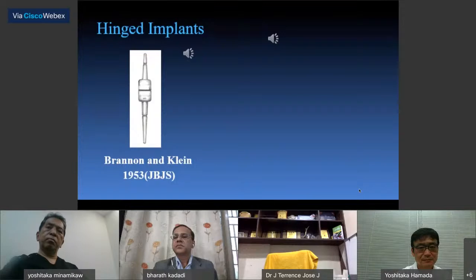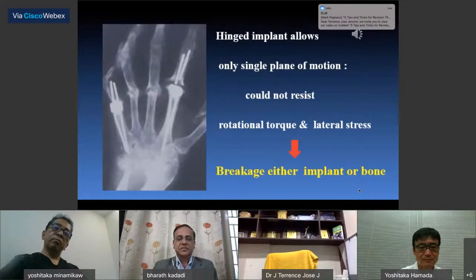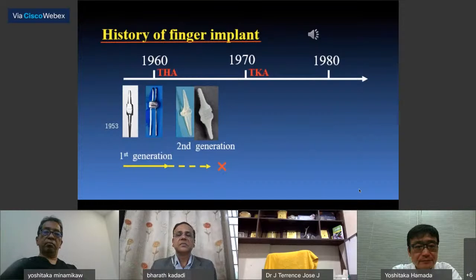Platt modified the single stem with more flexible and longer twin stems for better fixation, and it was extensively used for rheumatoid cases. The hinge implant allows only single plane motion, not rotational torque and lateral stress. Breakage of either the implant or the bone was observed in most cases. Within 10 years, the one-piece silicone spacer was introduced before complete failure of the hinged implant.